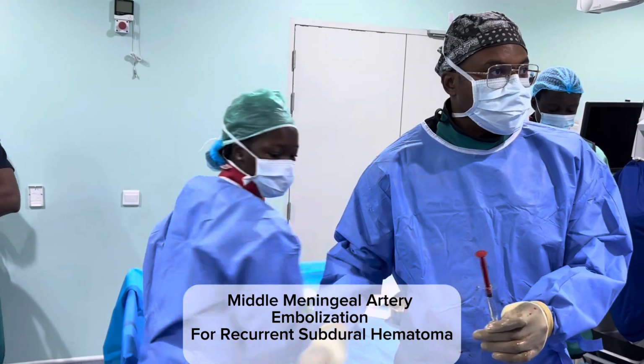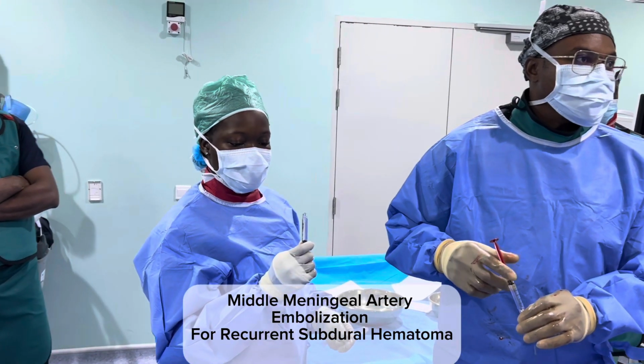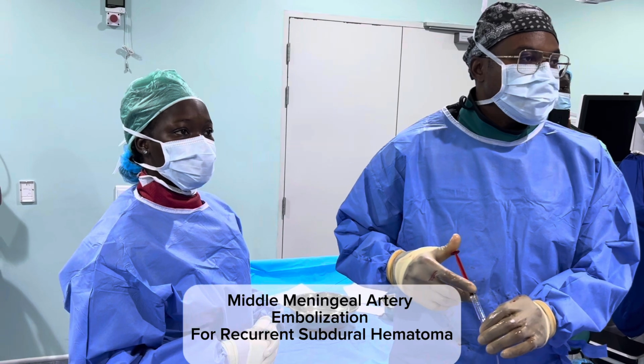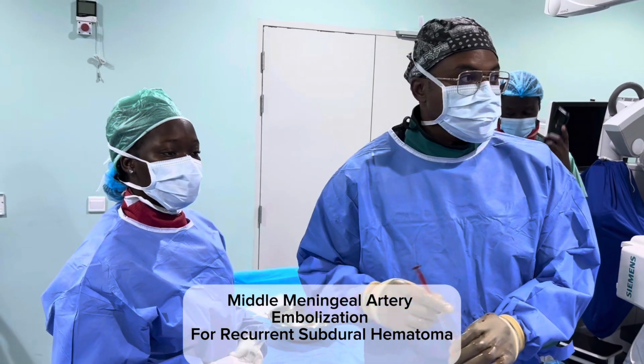So with middle meningeal artery embolization, we're going after the vessels outside of the brain that feed the scalp and feed the meninges, and basically stopping the blood flow to those meninges and decreasing the chances that the hematoma would return. Go on, roadmap.